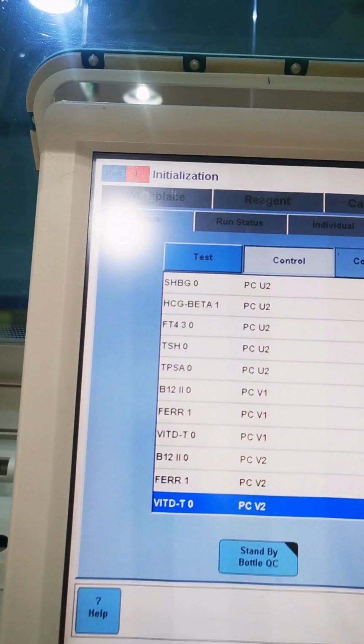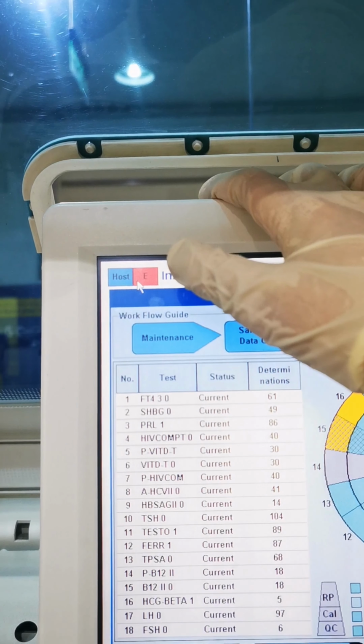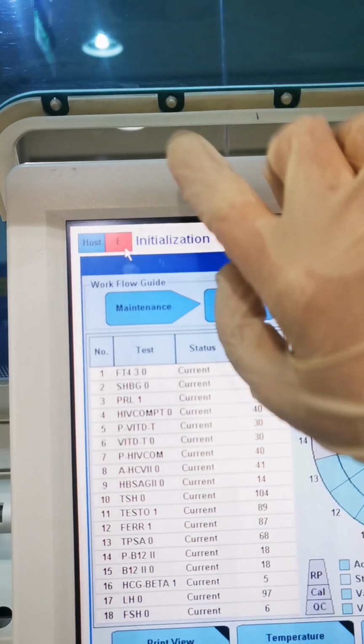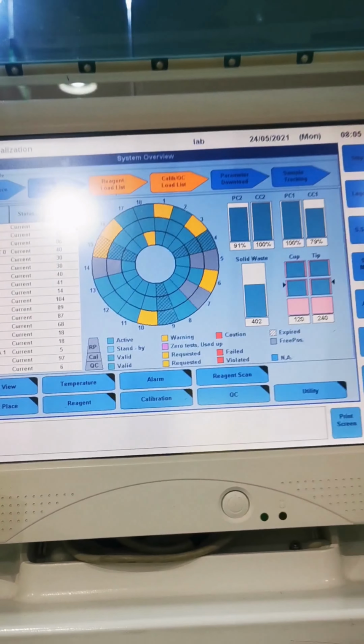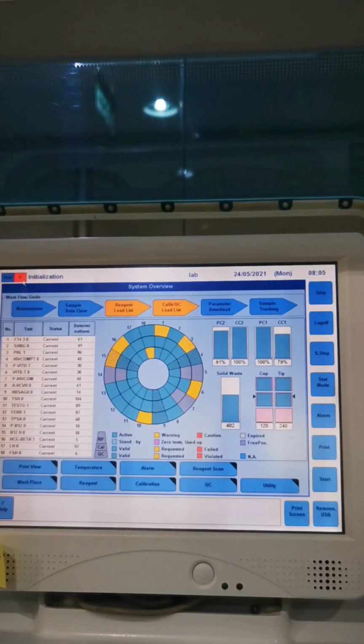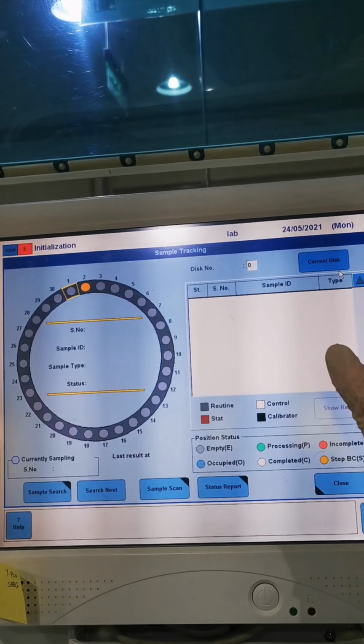To check on the status of the test, you can press the red button E on the left upper side of the monitor. Then you will see this on your monitor. Now on the upper right side, look for the word sample tracking, then press it.